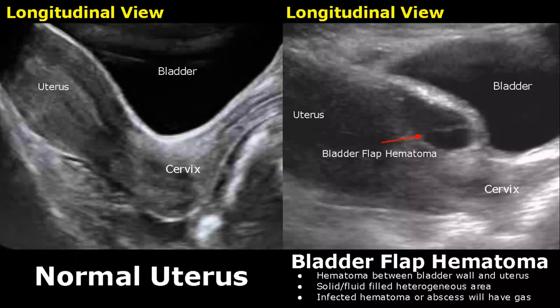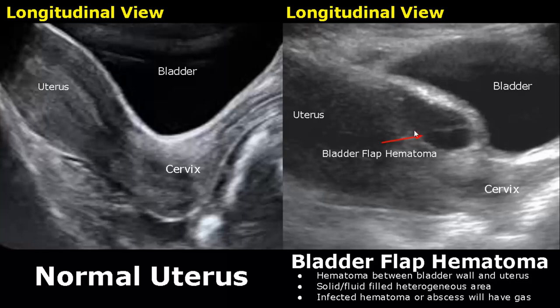Here is a transabdominal image of bladder flap hematoma. The hematoma is present between the bladder wall and the uterus.